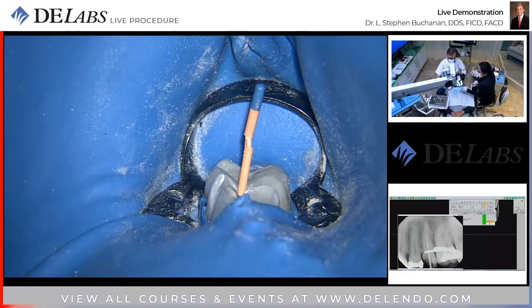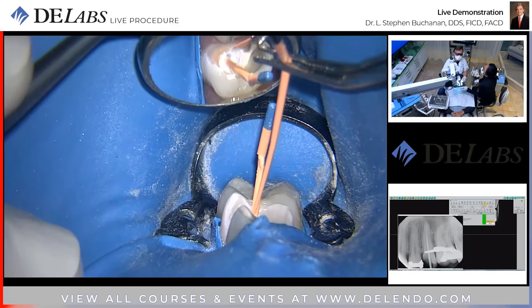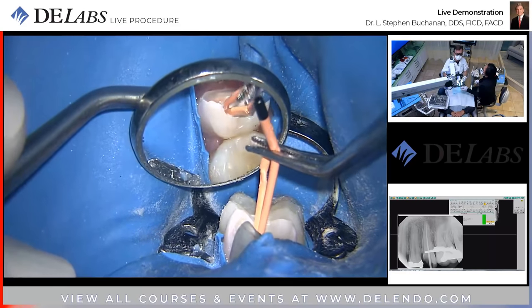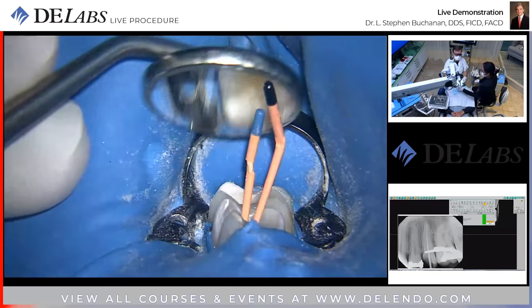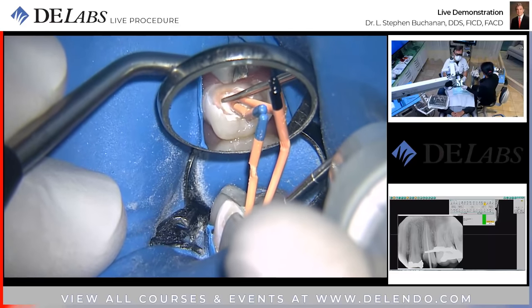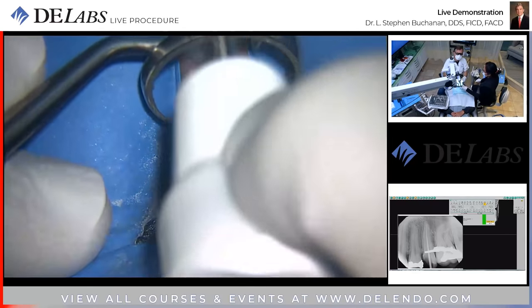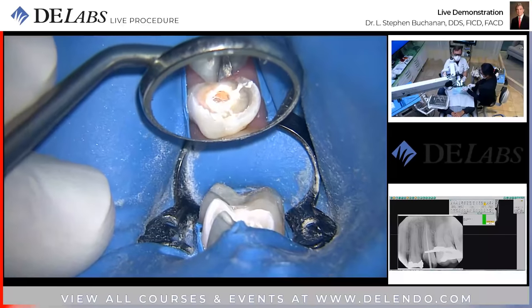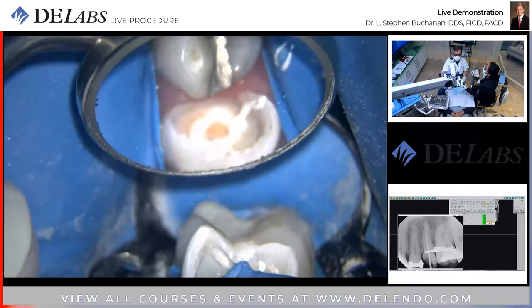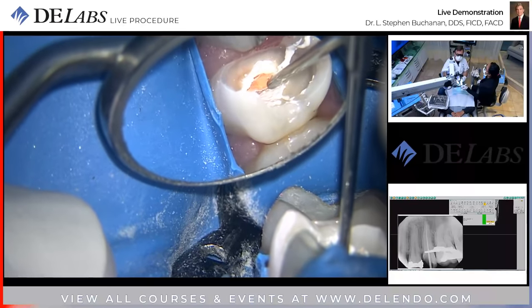This guy right here. Most common error made with an electric heat source is shorting the heating time. So heat it at least 2 seconds. Let it hang out on the gutta percha for another couple of seconds, and you're gonna get a much lesser chance of pulling the cones out, which is a little maddening. You just let them cool off, straighten them out.